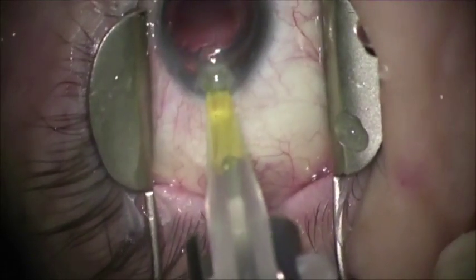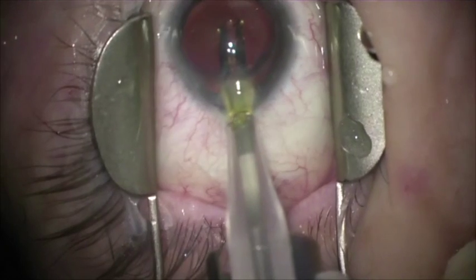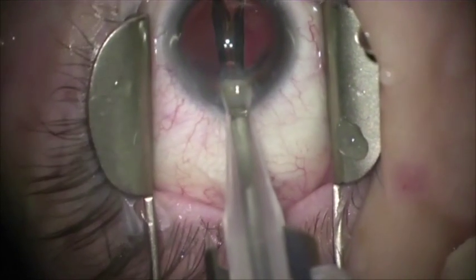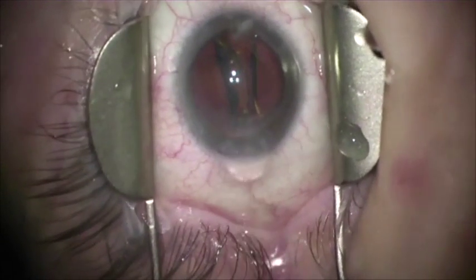Cataract's been removed and the lens implant is inserted. I use my standard one-piece posterior chamber implant.